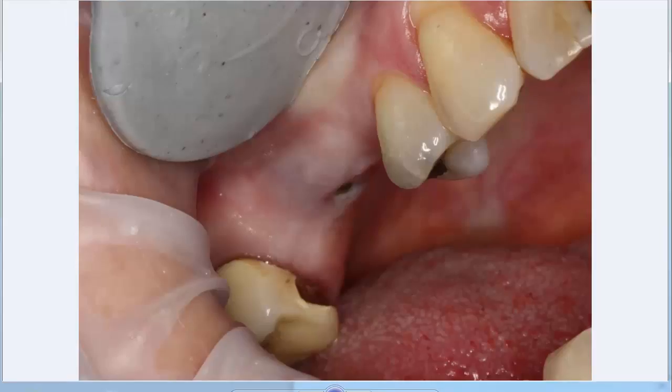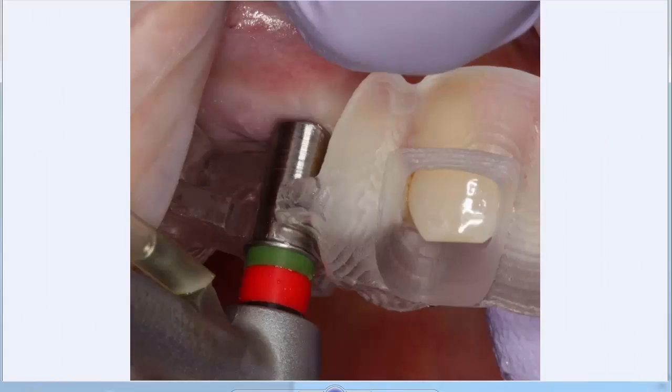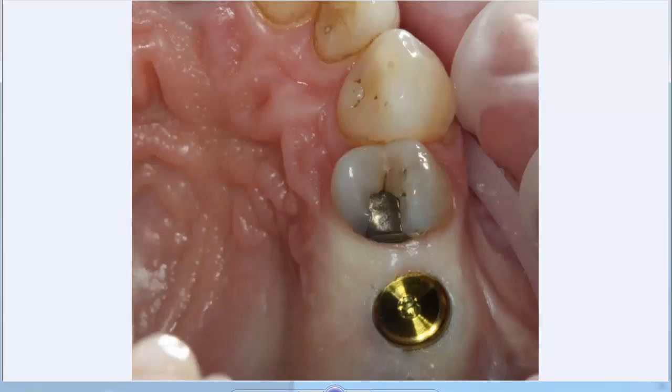In this case, the patient already had an implant placed in position three and we're placing one in site number four. The guide is tried on and verified. Once the Densaw drill is placed in, the entire vertical is controlled by the lip of the drill stop hitting the guide, and I have total control of the D2 value by putting smaller or larger silicone rings on. Here we can see the drill stop is making contact with the tissue — it probably would have been better to add an extra millimeter or two to my D2 for more clearance from the gingiva. I was still able to drill to full length and we end up with a very predictable implant placement. Thank you very much.